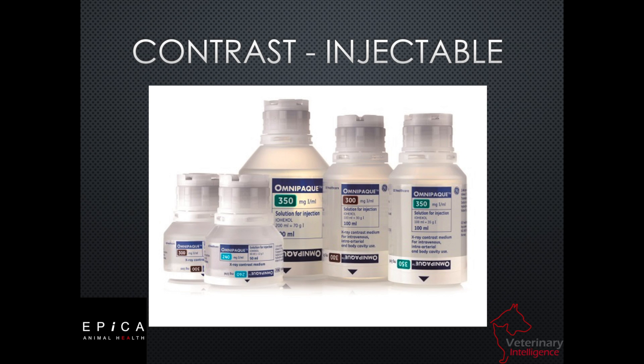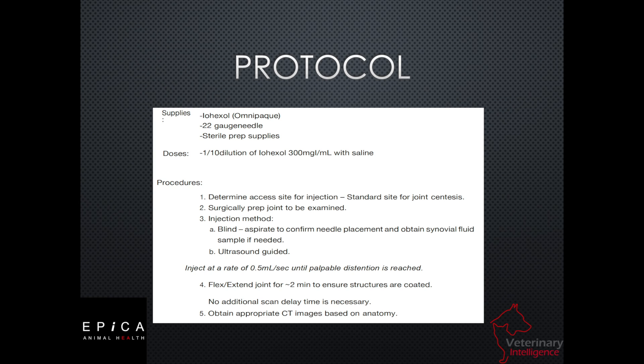We're going to use an injectable contrast. There are several different types that are out there. Iohexol is the one that we use most commonly. The 300 concentration is also the one that we think is most cost-effective. We're going to dilute that down just a little bit — one to ten parts of saline. So one part Omnipaque, ten parts saline.